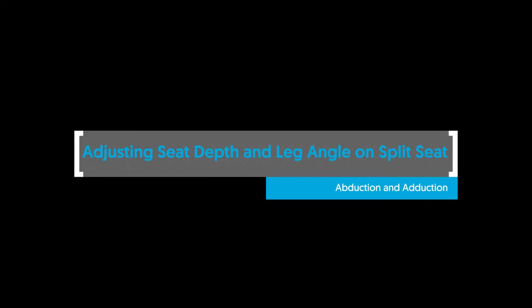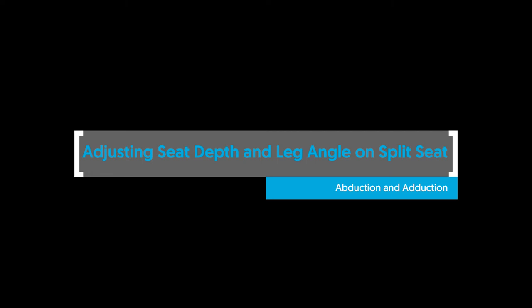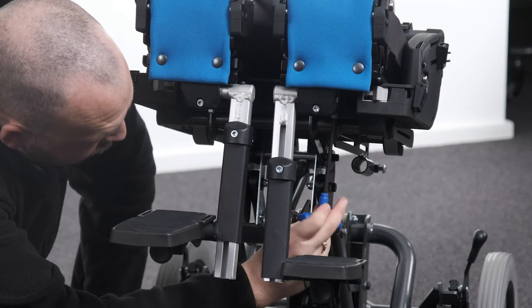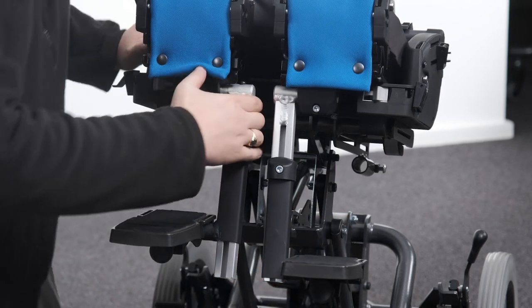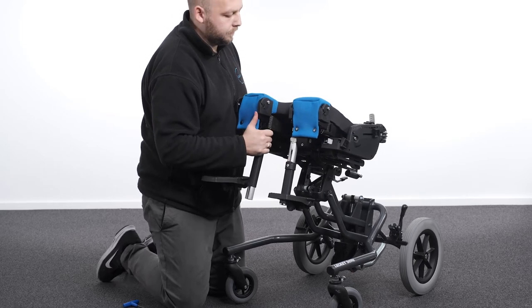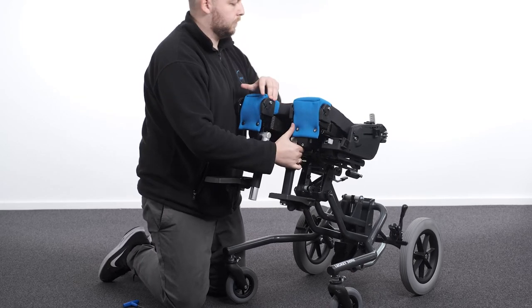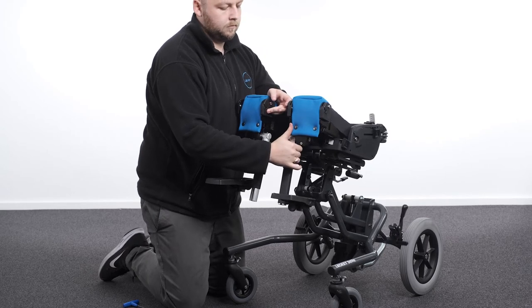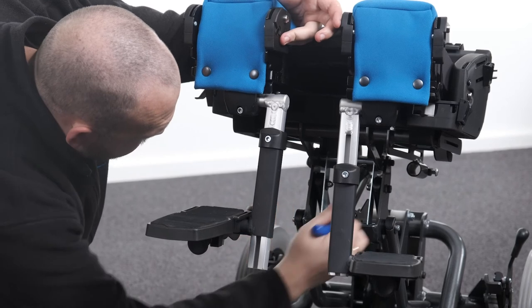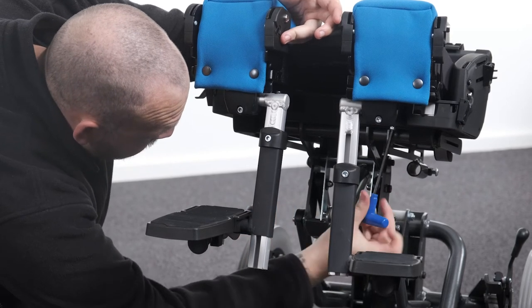Adjusting seat depth and leg angle — abduction and adduction on the split seat. To adjust the seat depth and leg angle on the split seat, loosen the left and right bolts on the underside of the seat base and move each seat leg component separately to a suitable position. The seat leg components can be moved forward, backwards and to 15 degrees abduction-adduction. Tighten both bolts to secure in place.